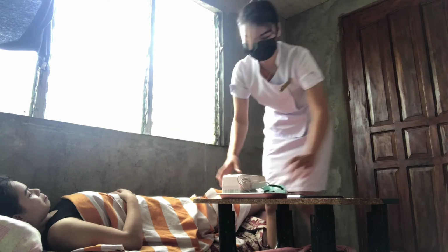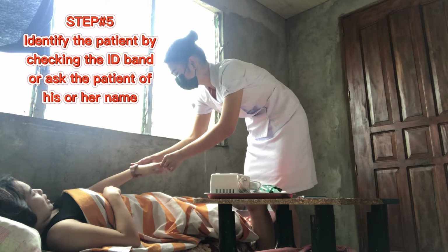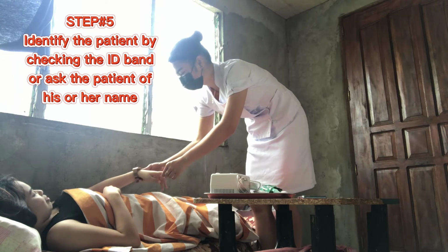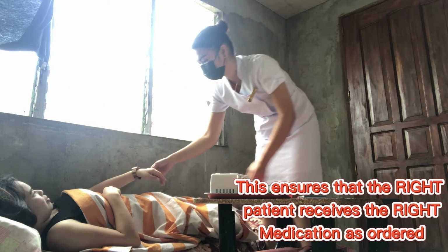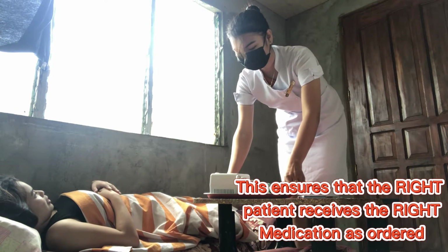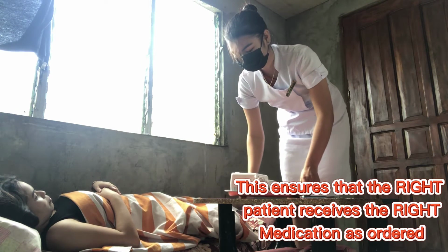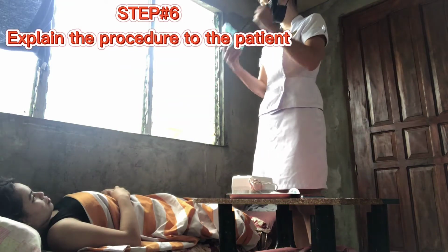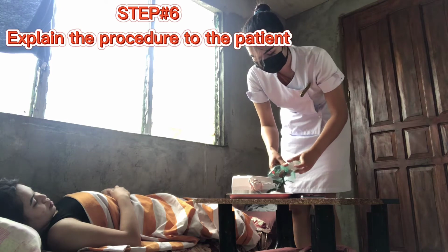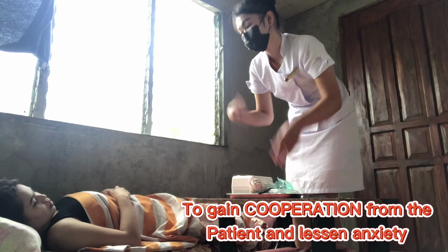Step number 5. Identify the patient by checking the name and identification on the patient's identification band or ask the patient to state his or her name. Identifying the patient ensures the right patient receives the medication and helps prevent errors. Step number 6. Explain the procedure to the patient. This helps to gain cooperation and to allay anxiety.